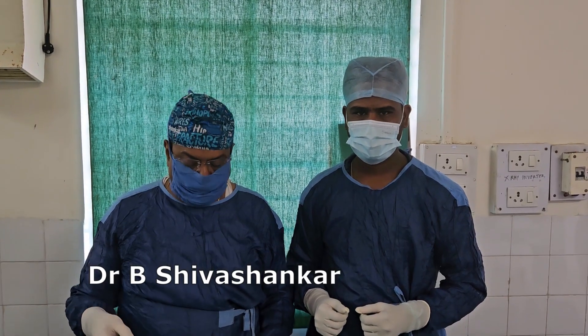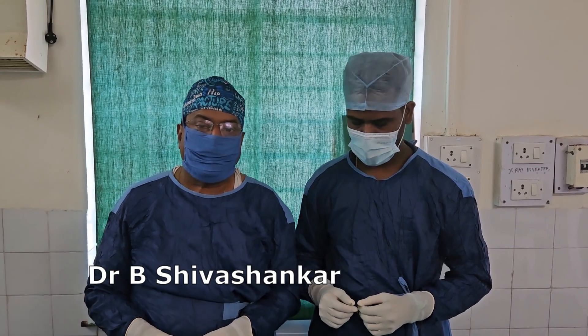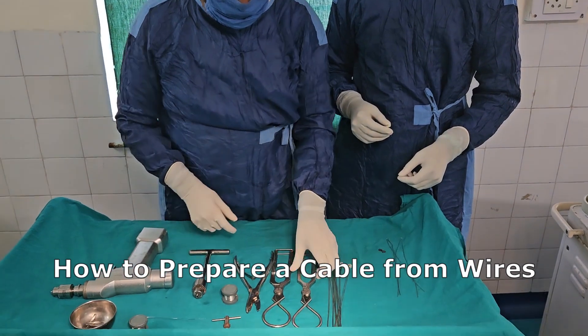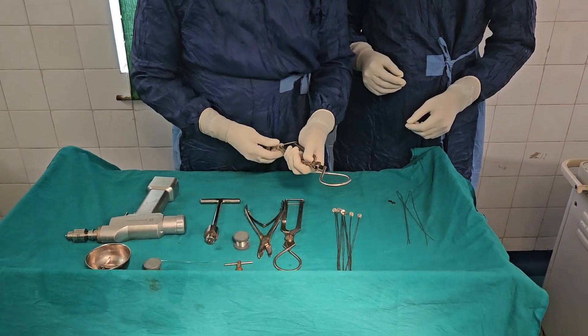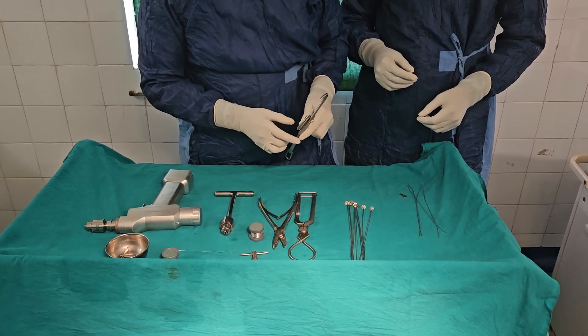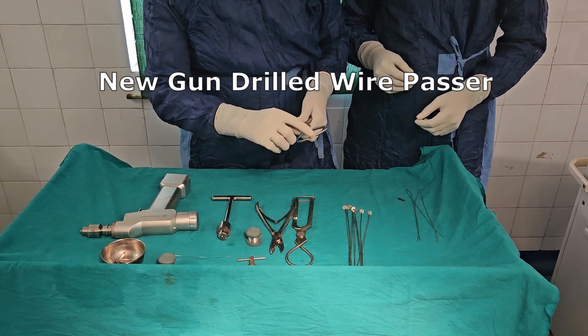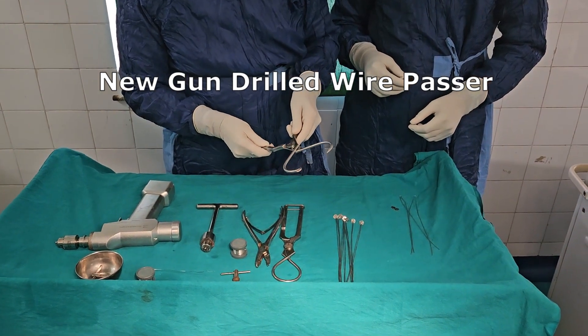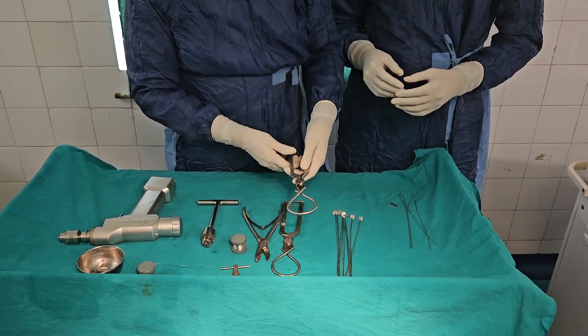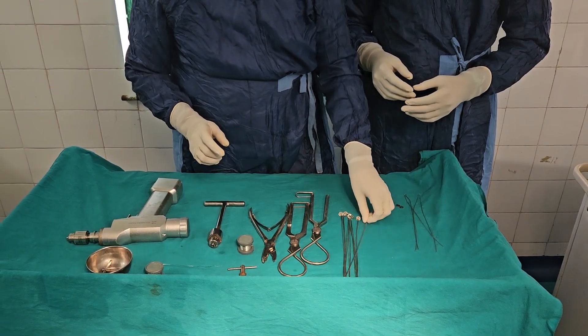Today I am demonstrating how to prepare a cable. This is a wire passer — a new wire passer which is gun drilled. Because of the gun drilling, the chances of mismatch are very, very less. And this is how I prepare the wire.